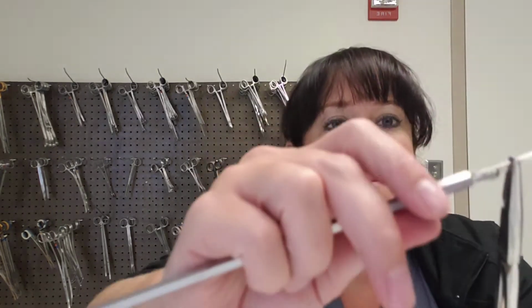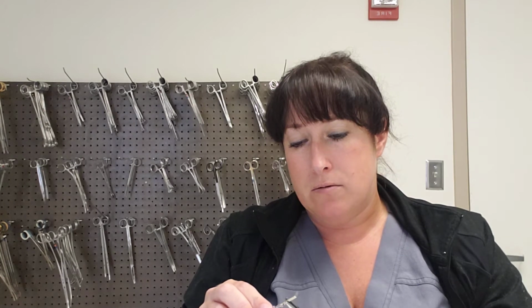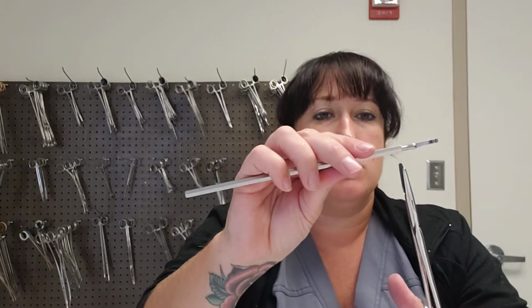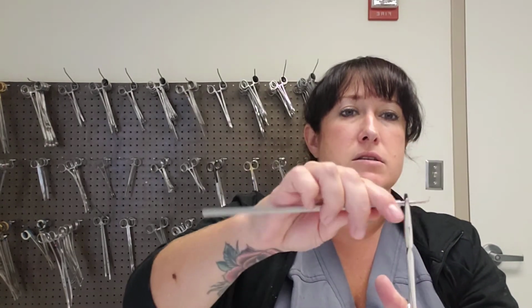There we go. So there's like this little slit that you're supposed to get in there, and you will cinch it down until you can't cinch it down anymore. And then what you can do is you can hold this thing that you just cinched that into, and then you'll turn this until it's nice and snug, and then you got yourself a loaded beaver handle.